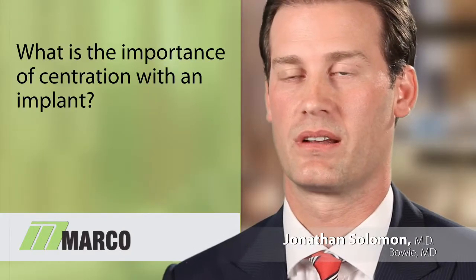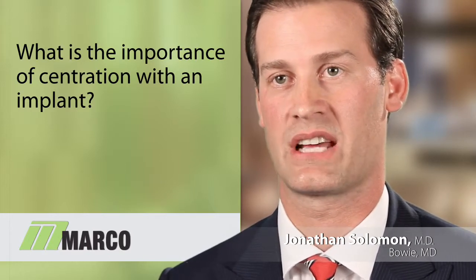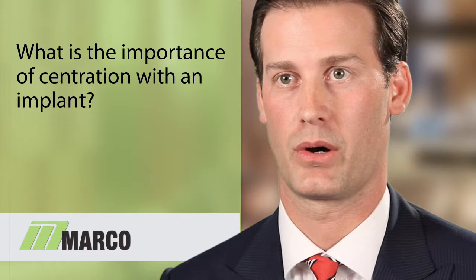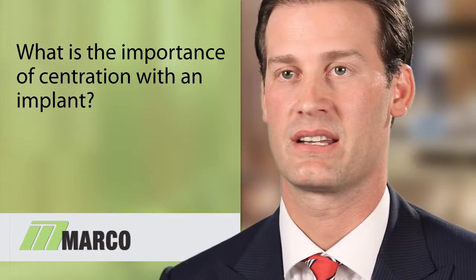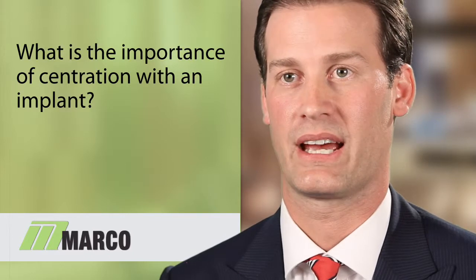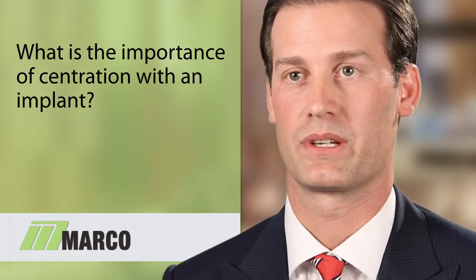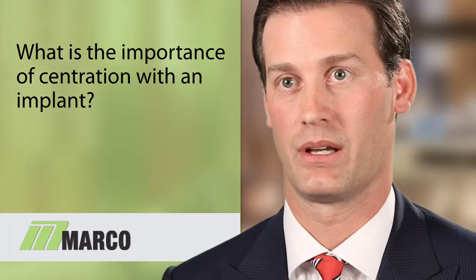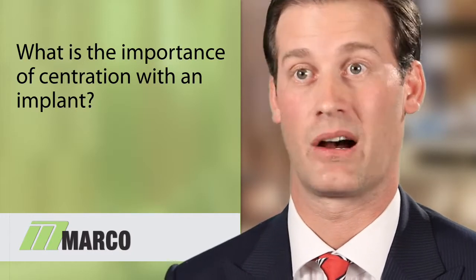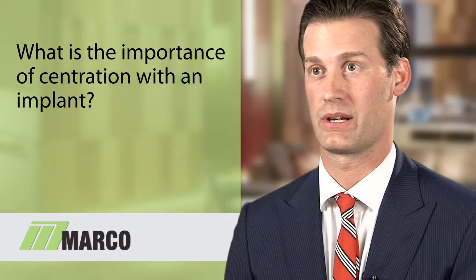The importance of centration with an implant is particularly key when you are leaning towards not only aspheric implants, but certainly multifocal implants. It is not uncommon to encounter a patient in your clinic who very well may have a significant discrepancy of line of sight, what we sometimes call angle kappa, but more importantly call angle alpha. And that is something that is easily measured with the OPD-3.